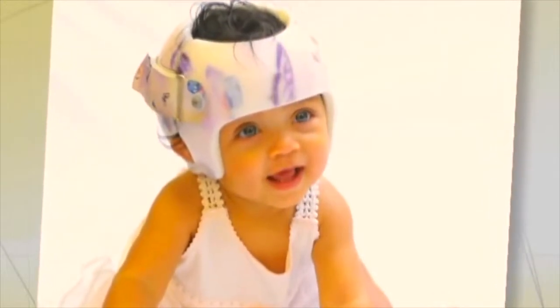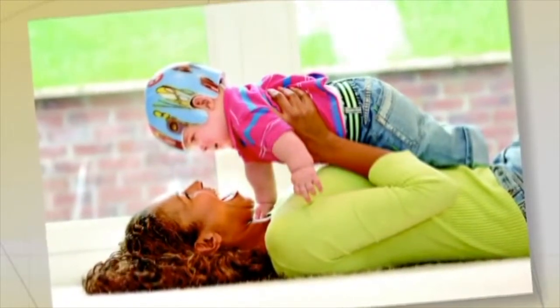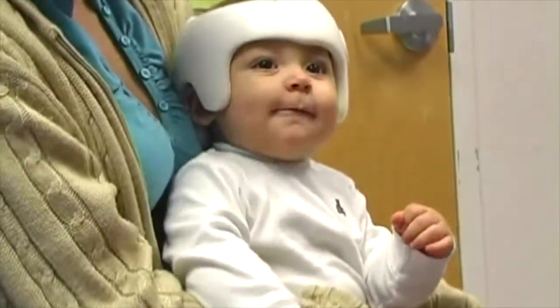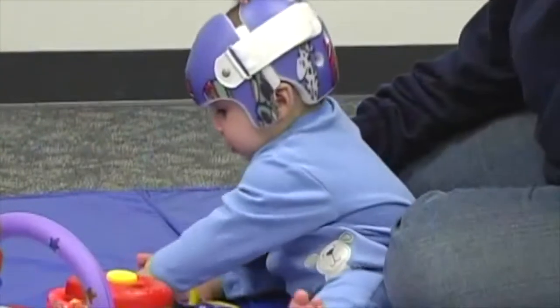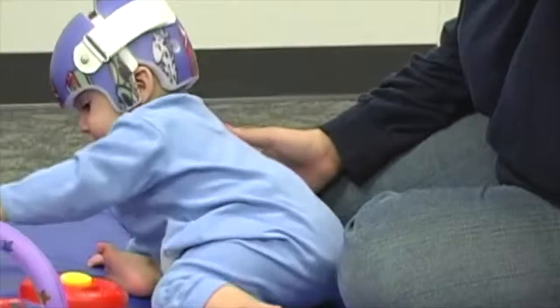The Star Band itself is available in five different styles, so each band completely addresses a specific head shape deformity. The options available to families with the Star Band and Star Scanner treatment through OrthAmerica are far greater than in any other type of program.